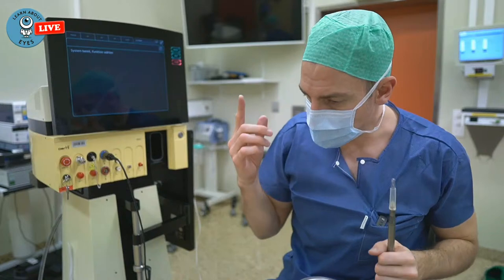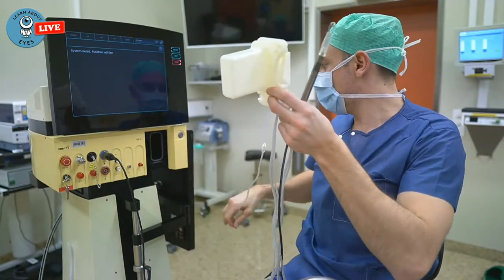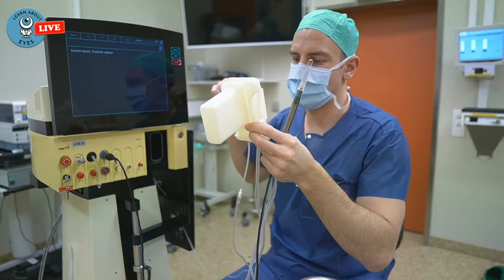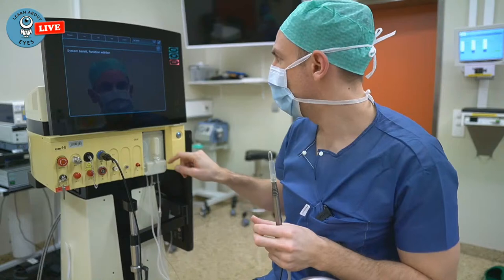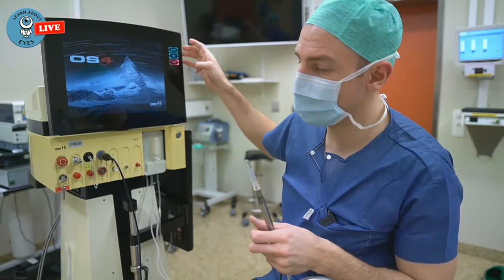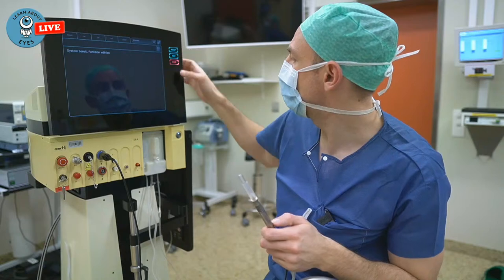Okay, so now this part always confuses me. I'm not completely sure. I'm hoping I'm doing it right, otherwise you have something to laugh. So this actually goes in here. I have connected the water through here, which I'm not completely sure if it's right, but we usually find out soon enough. Push it in and then go pre-op. No? Go reset, sorry. Maybe not.